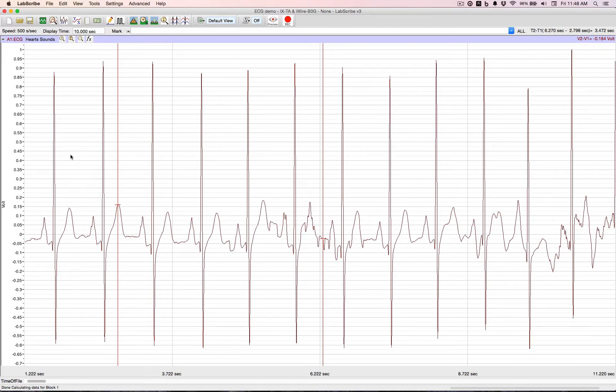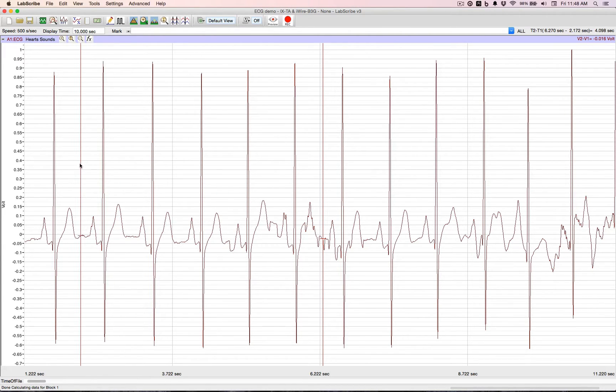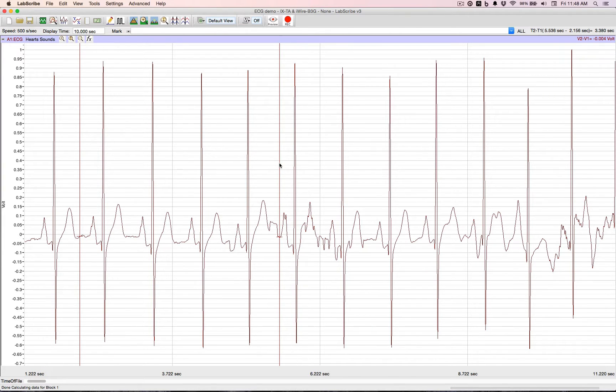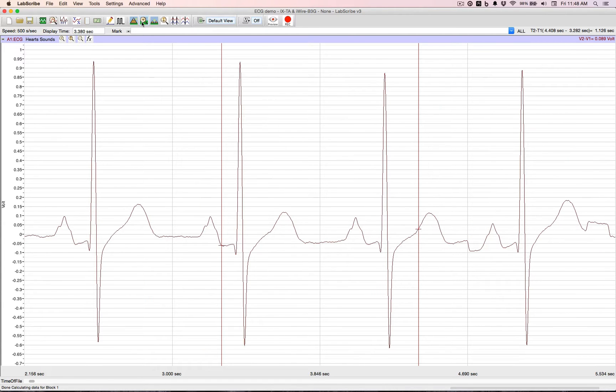Let's home in on about 4 beats using the double cursors, we'll zoom between them, and then we'll go over to the analysis window.